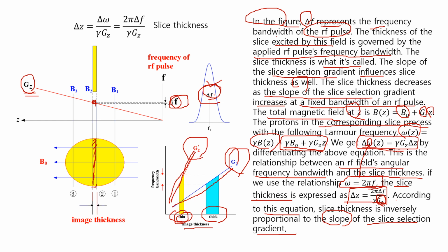In other areas, the protons cannot be resonated because the frequency of the RF pulse does not match with the Larmor frequency.